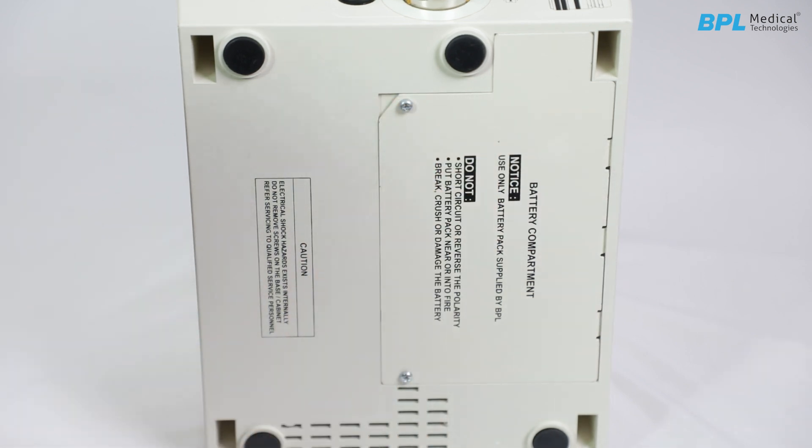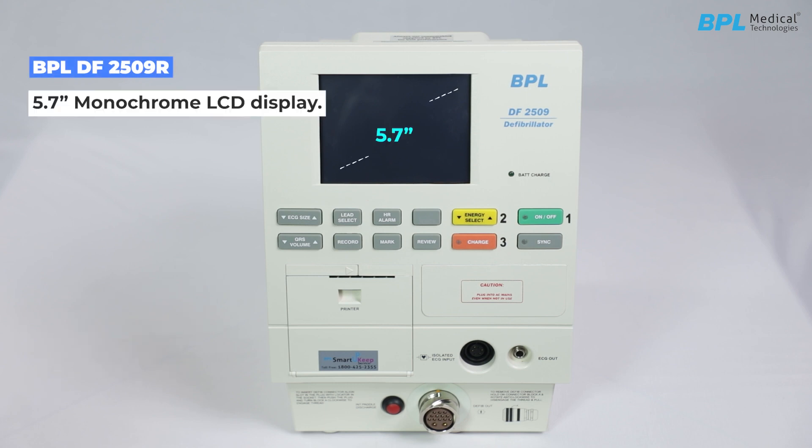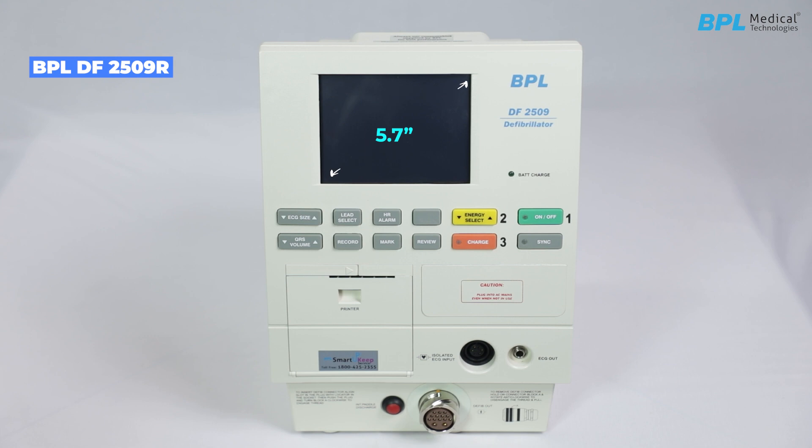Keep the equipment upright. Device overview: the DF2509R is a portable unit featuring a 5.7-inch monochrome LCD display. It combines a 360-joule defibrillator, ECG monitor, and a thermal printer, all packed into a compact and lightweight design.